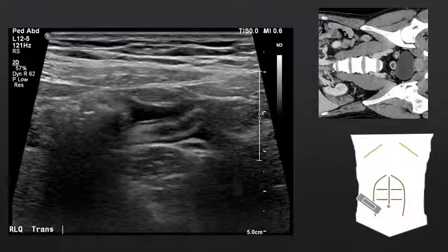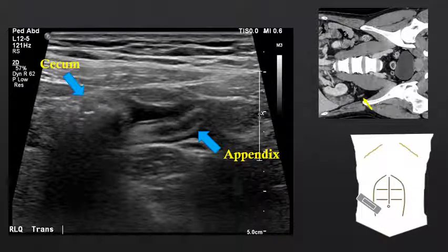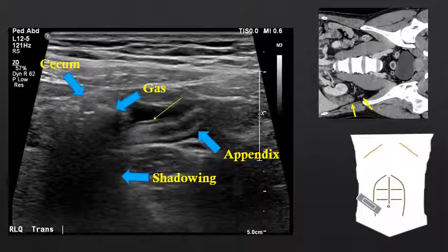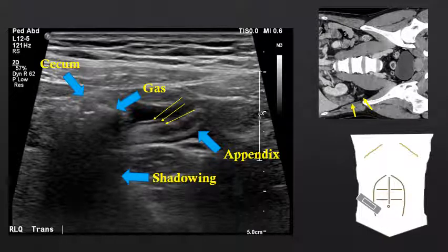As we continue to ultrasound the right lower quadrant, another portion of the bowel comes into view — the appendix. The appendix is going to arise from the cecum. In this case, the cecum is gas-filled or stool-filled, and there is shadowing deep to the cecum. Notice the characteristic three-layered wall of the appendix, and in this case the appendix is slightly outlined by hypoechoic fluid, which makes it easier to identify.